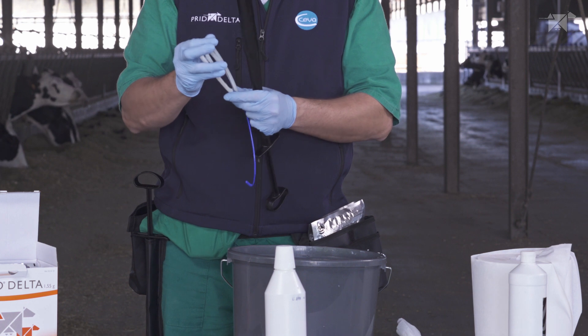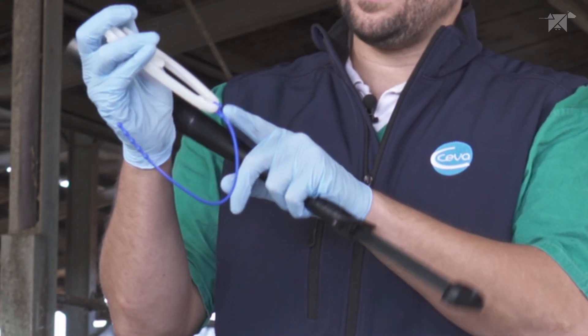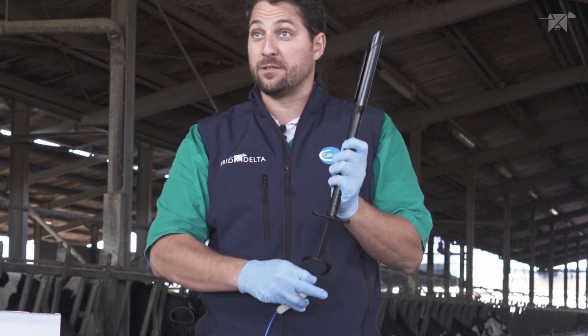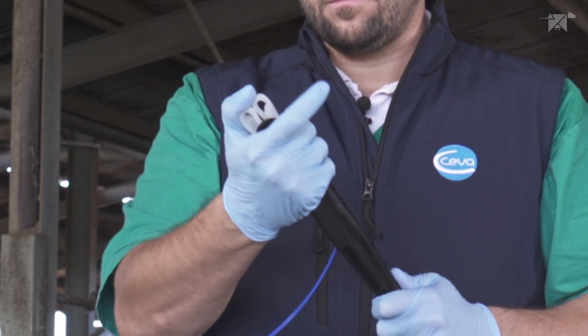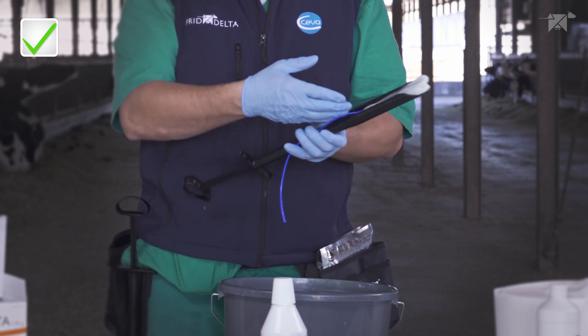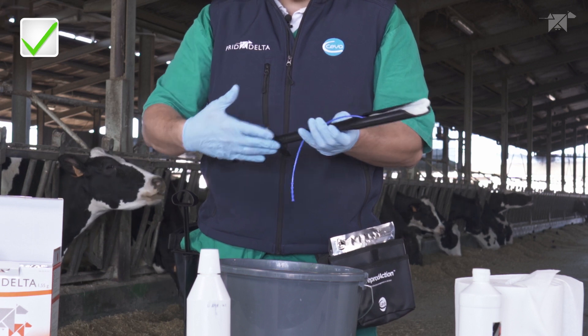Fold the device and ensure that the 90-degree bend is going to be engaging inside the plunger of the Predelta applicator. When the device is correctly loaded, the tail will be on the same direction as the Predelta applicator.